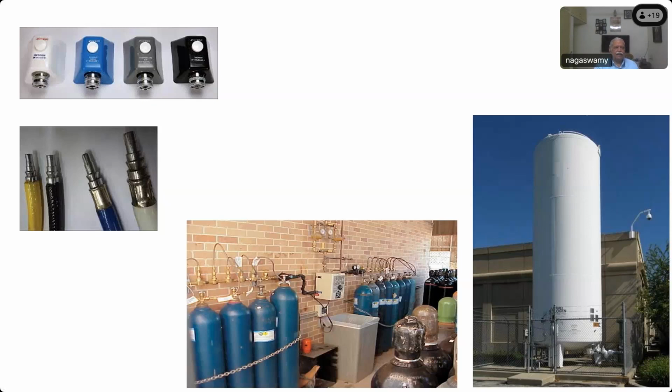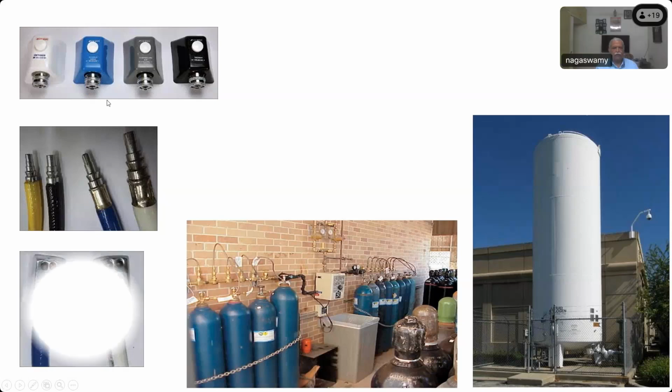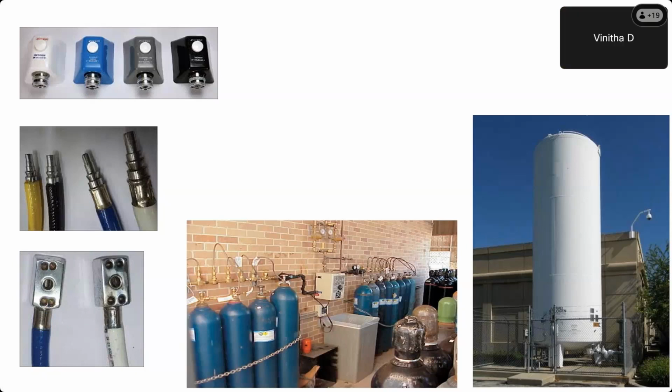So this is the probe. When you push it, these are called quick couplers. Schrader valve or quick coupler is also not the correct name. And what is this? Nut and stem. Nut, stem, body. Where will it go? Where is it attached?